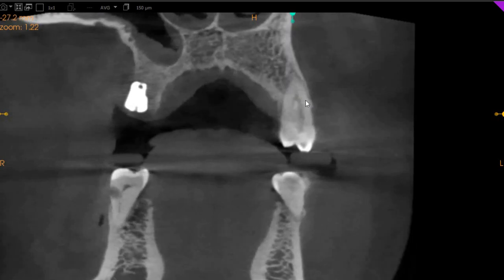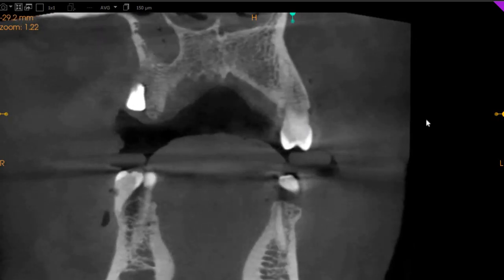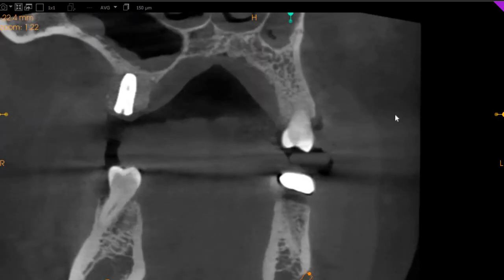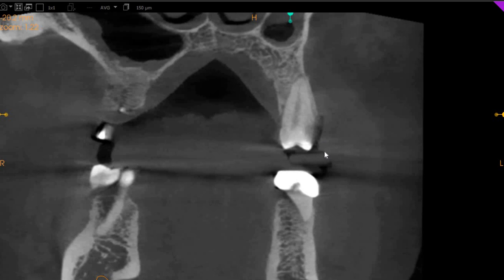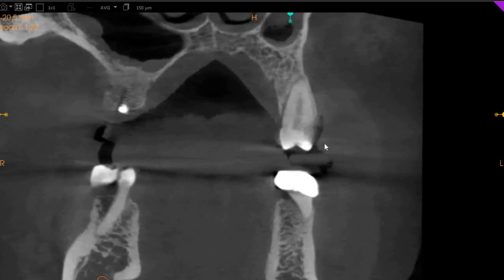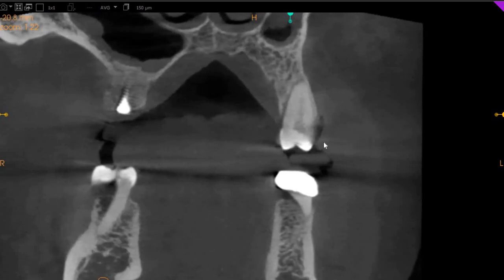The upper left four is where two canals would join to form one at the apex, so this has a 2-1 configuration. Again, no radiolucencies or cracks can be observed in these teeth. This is the upper left five.